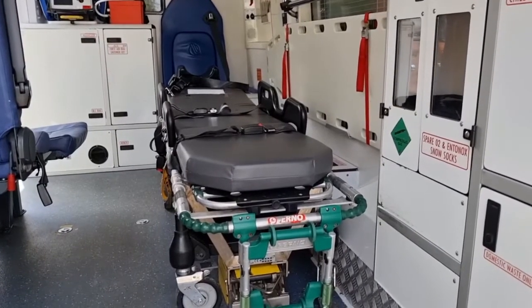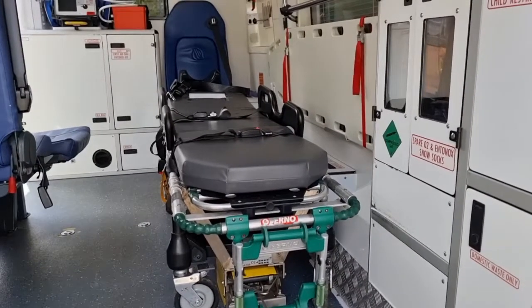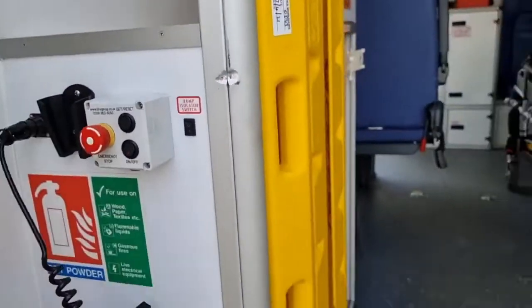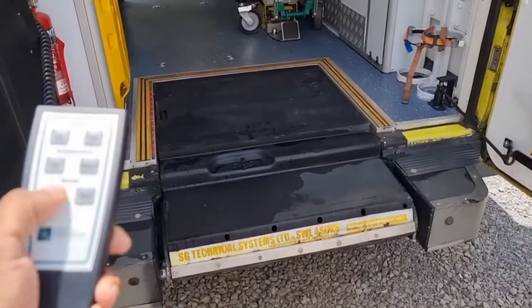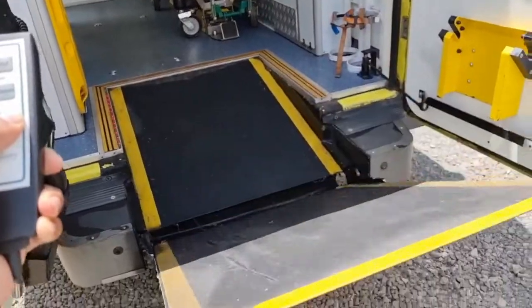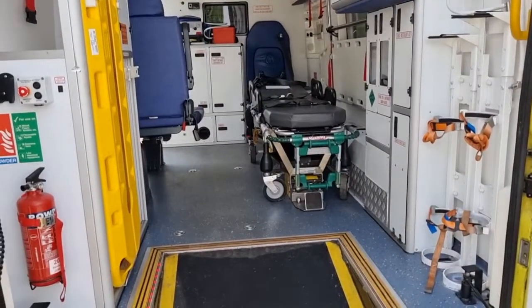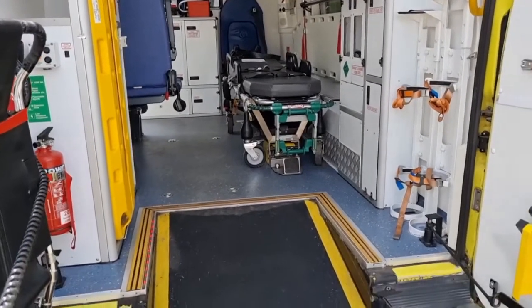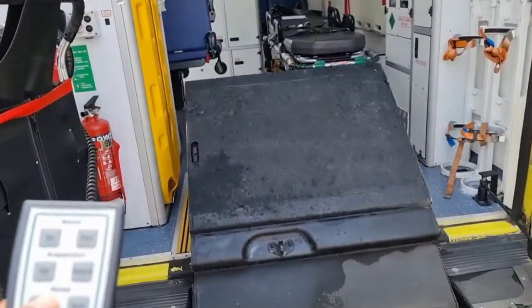a fully retractable and movable stretcher which comes out, and then we have the ram, which I'll show you guys what it's going to do. So as you can see, the stretcher can be moved with the ram, so that the stretcher can easily come out and also easily be loaded into the ambulance as well. So that's a few things there. Let me just put it back. So quite easy, just pressing a button and it does that all.